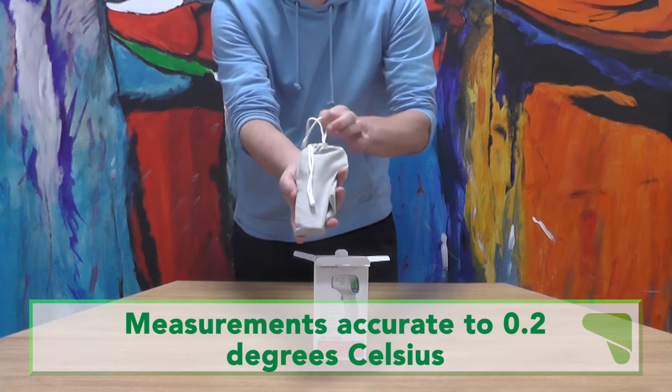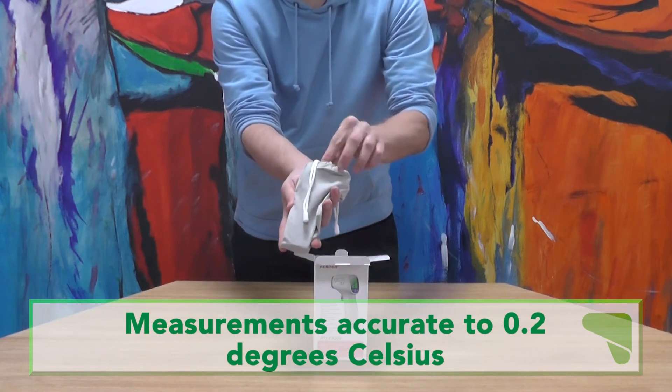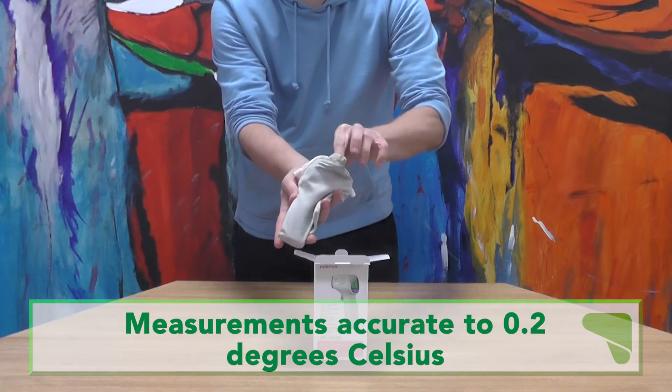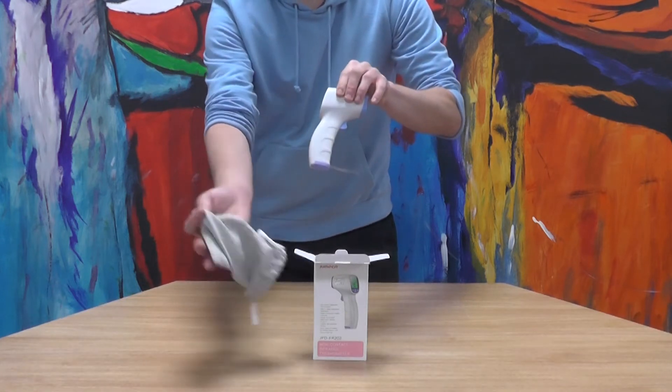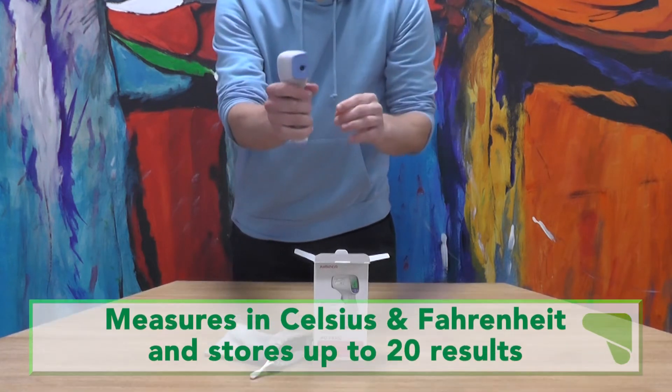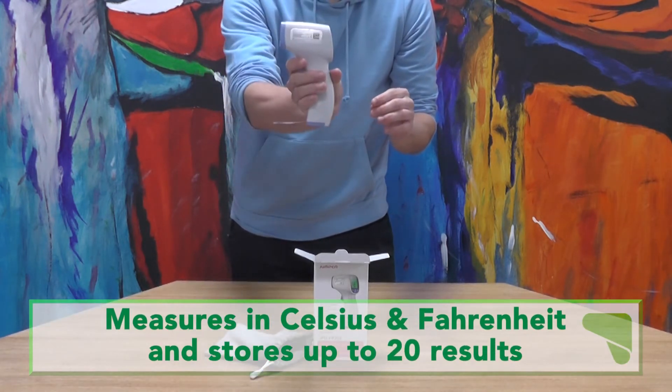The thermometer is hygienic and secure, as the non-contact design means you can stay at a safe distance from the person you're assessing. It also has an alarm function, which will alert you if a fever is detected. This alarm can be set to silent, or a clear ringing function.